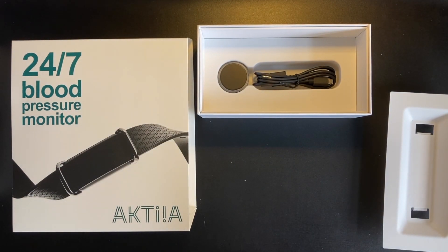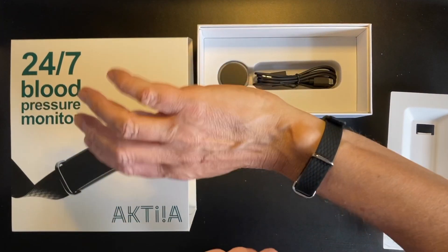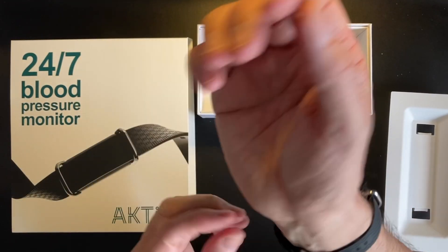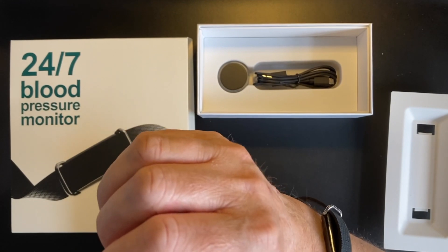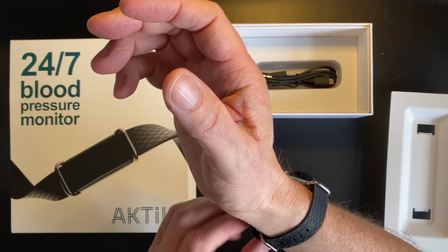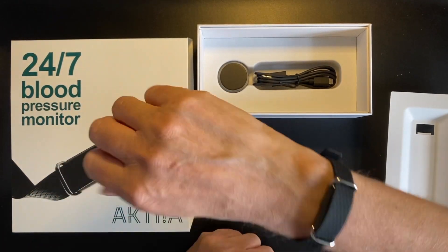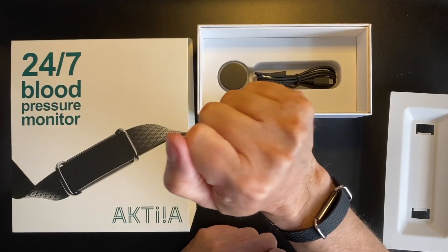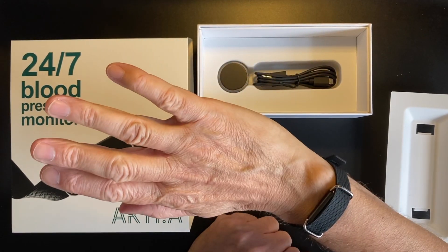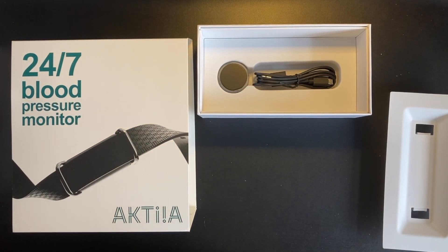It's a really nice silicone strap, very lightweight, and as you can see I have it on my wrist — it looks pretty nice and it's really comfortable. I've had this for about three days now, worn it 24/7, and I've even slept in it. The only thing you can't do is shower with it, as it's not waterproof, but other than that it's been on continuously.